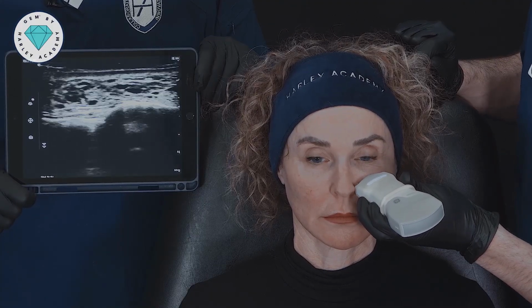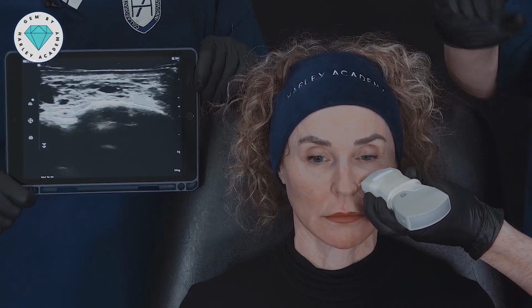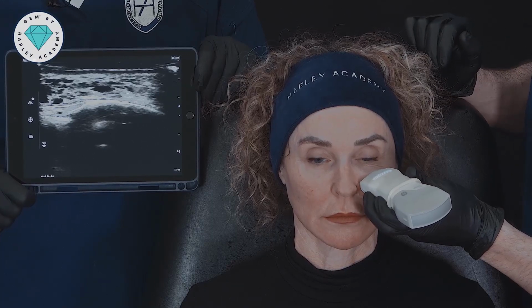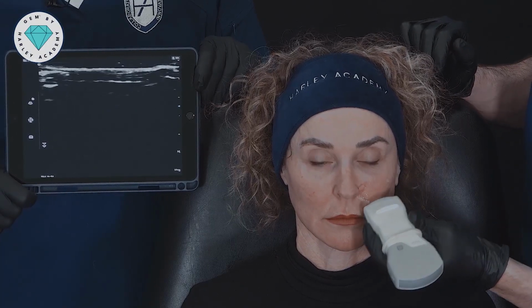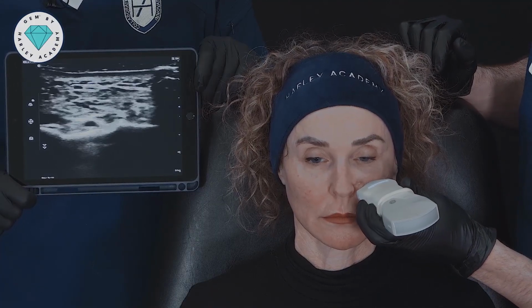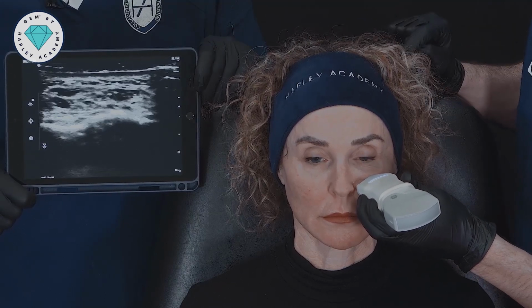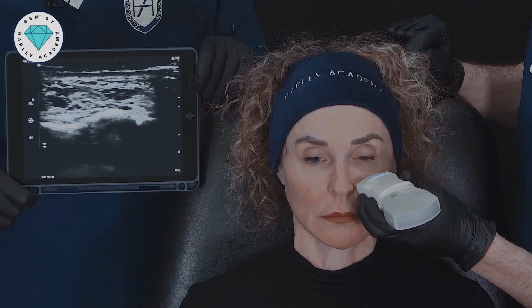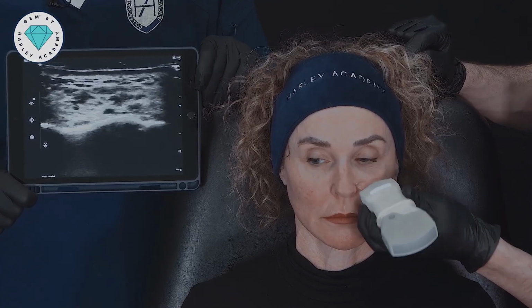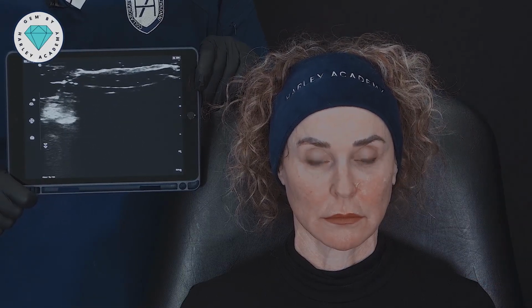This could either be sitting in the SMAS itself, or in the space between the SMAS and the lip elevator muscles, the pre-maxillary space. But what I can't see is a huge amount of filler down here in the true deep medial cheek fat. So it's all sitting a little more superficially than we would like, which probably explains why it's bunching up during animation. We'll have a look on the other side as well.